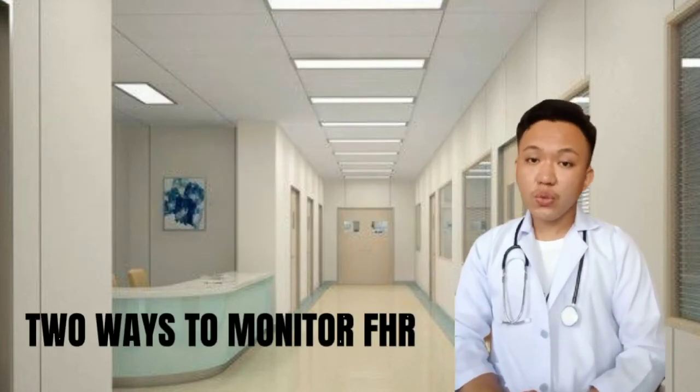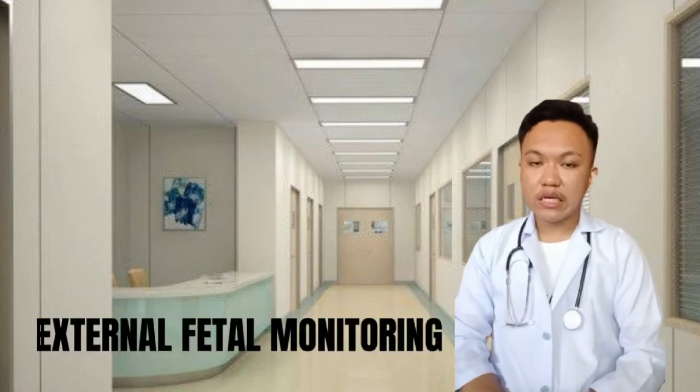So, there are two ways to monitor the fetal heart rate. First is the external fetal monitoring. It is non-invasive. It uses a device to listen to or record the fetal heartbeat through the mother's abdomen.